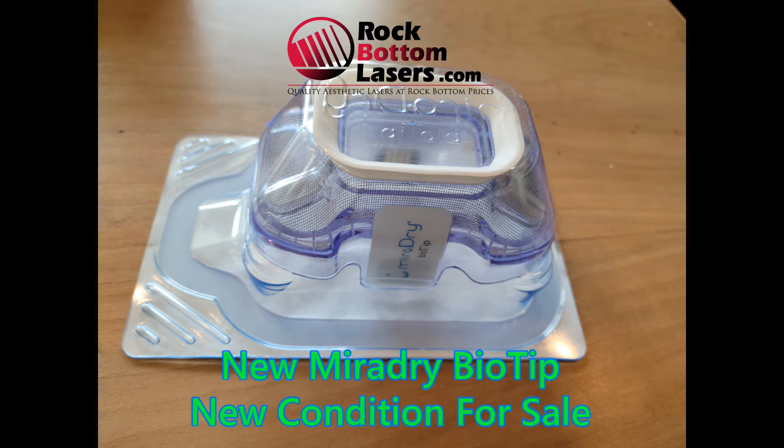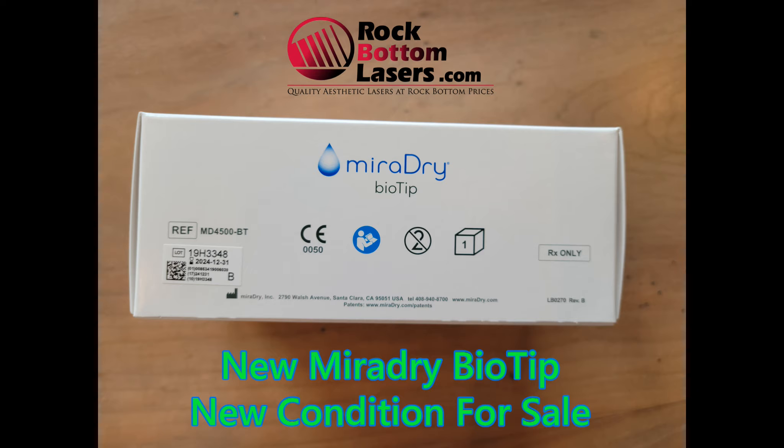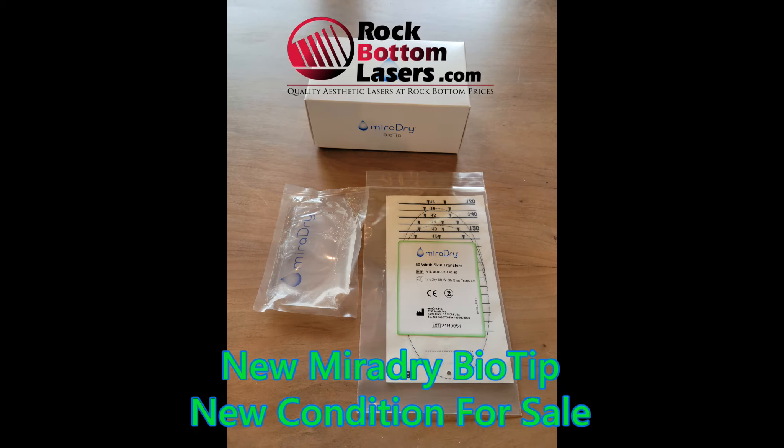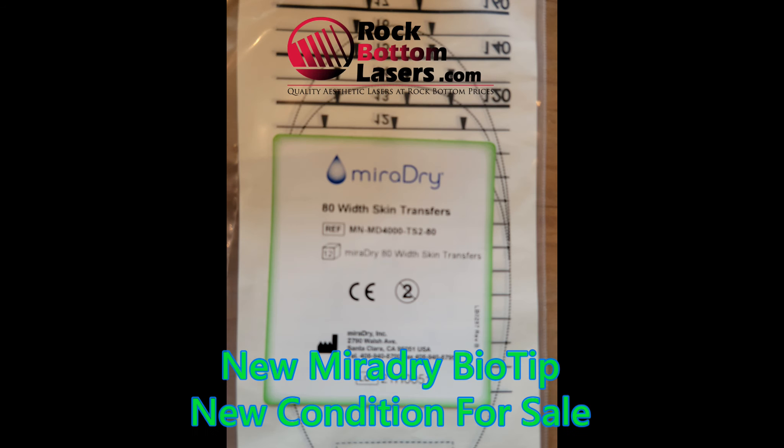Hi guys, Vin Wells here with rockbottomlasers.com. What I am featuring today is a MiraDry BioTip. I have a limited quantity of these particular tips. They are very rare, very difficult to find, but I do have a limited quantity of them available for sale, and these do not expire until December 31st, 2024, and these are the MD4500 tips.